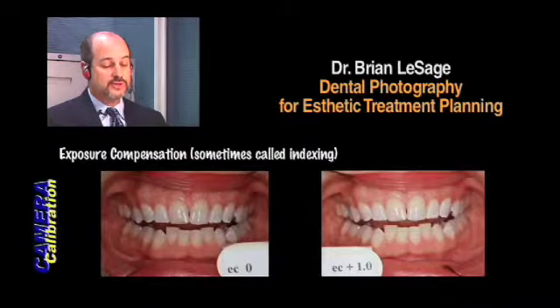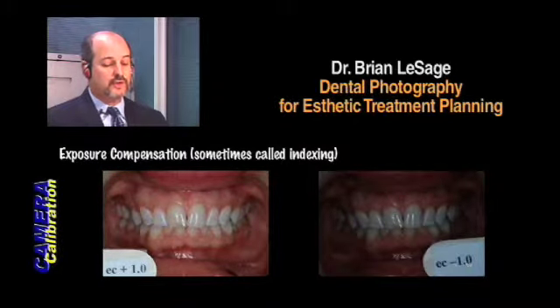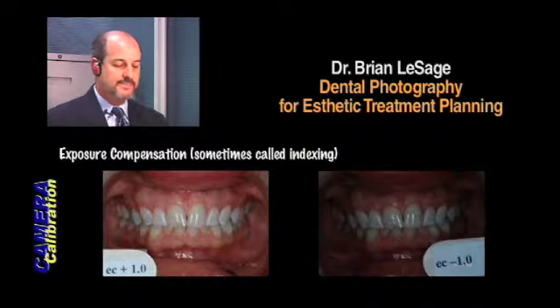Actually, to be honest with you, in the Yashica Dental Eye camera, you could either shoot at f16 or f22. You always would rather pick a larger f-stop if it's still going to be acceptable, because then you have a larger depth of field. So there's really the key.